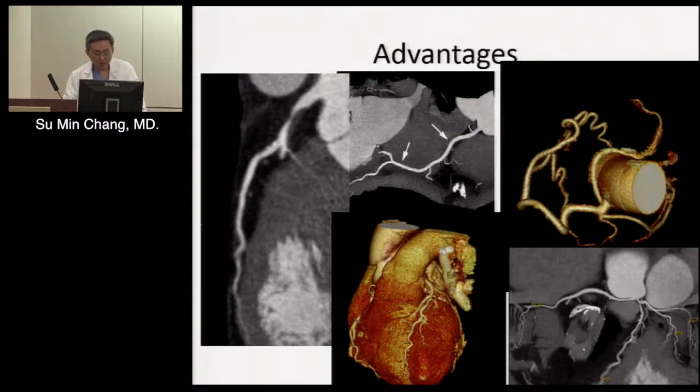On the left-hand side you can see the plaque. This is a patient coming to the ER with chest pain. Young guy, a smoker, a little bit of calcification right here. You can see the white speck, but mostly in the left main, a very, very hypoattenuated lesion, a very high-risk feature. So he went to bypass surgery.